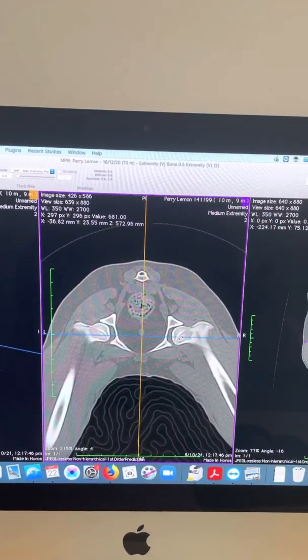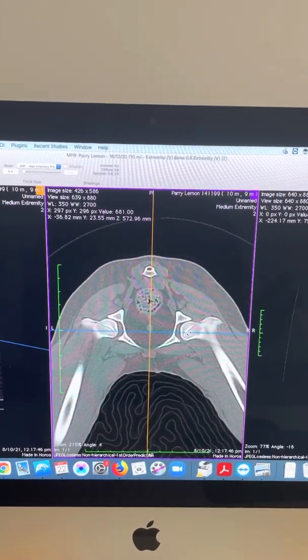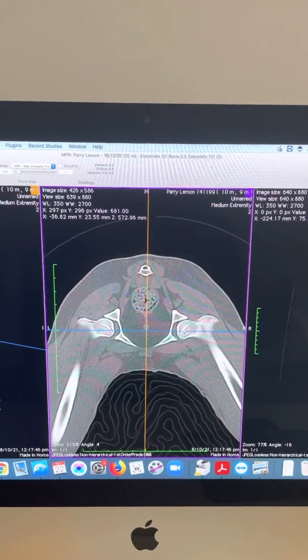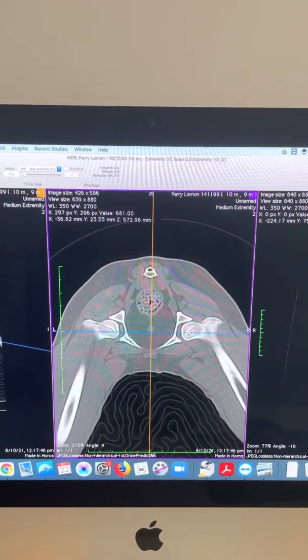Arthritis on CT scan is a big thing. If there's any degree of arthritis, I won't actually perform the DPO procedure — I prefer to treat them medically and then at some point consider doing a hip replacement in the future.